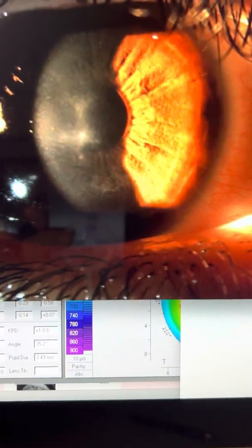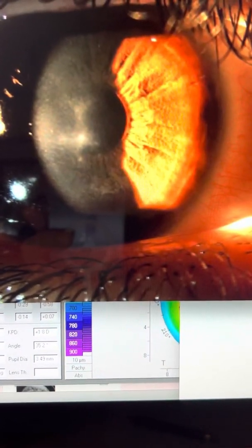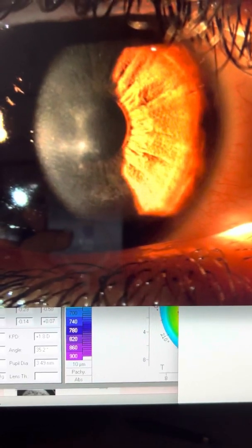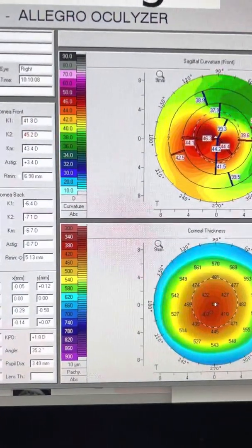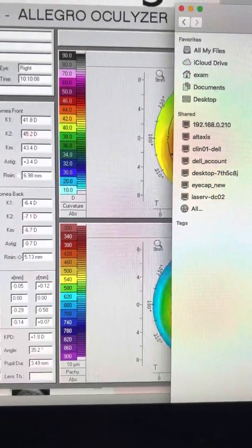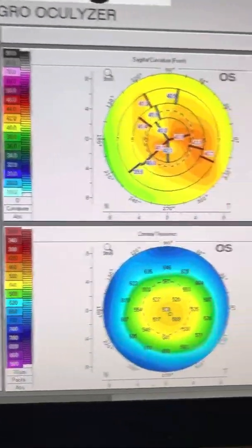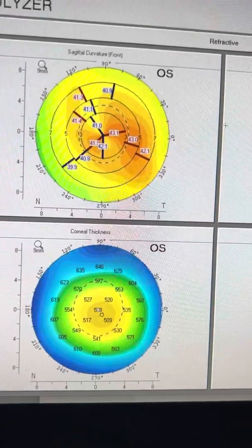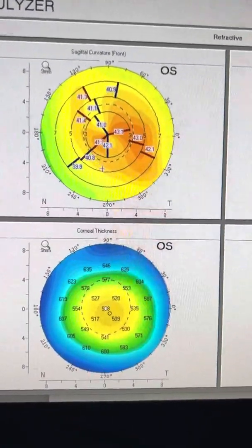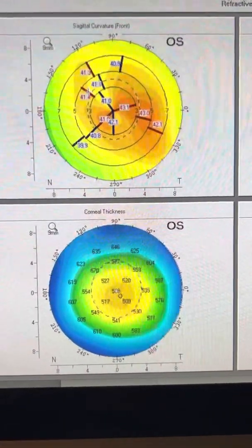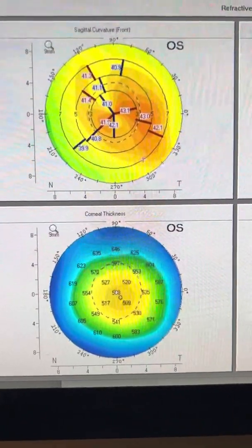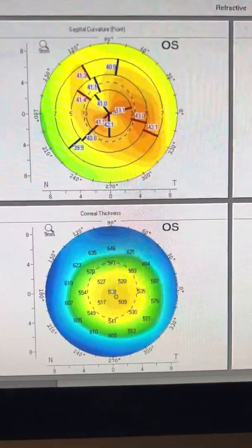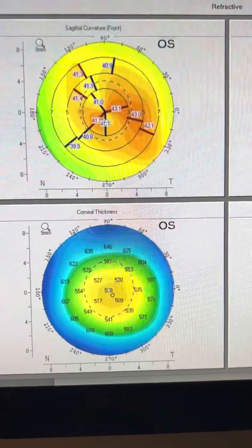Until this resolves, I wouldn't really do nothing further for this patient, as his left images on Pentacam today are relatively good. We can see that the Pentacam reveals on the sagittal curvature map that the cone is cooking. And at 17, if he stops rubbing his eyes, this may remain stable.